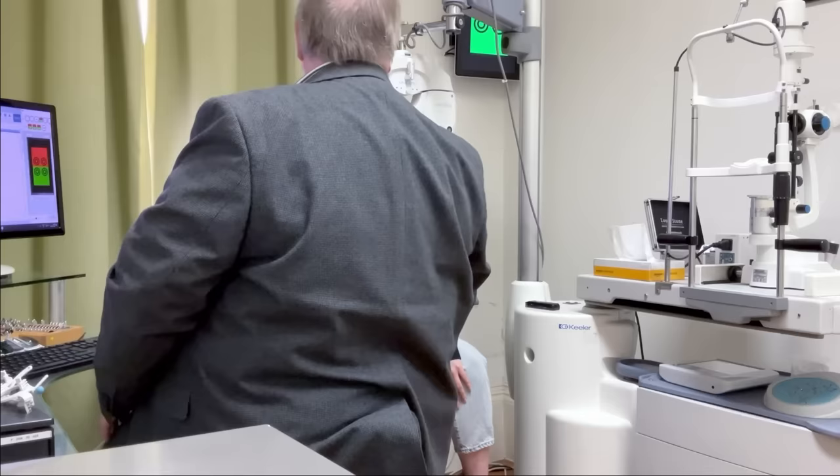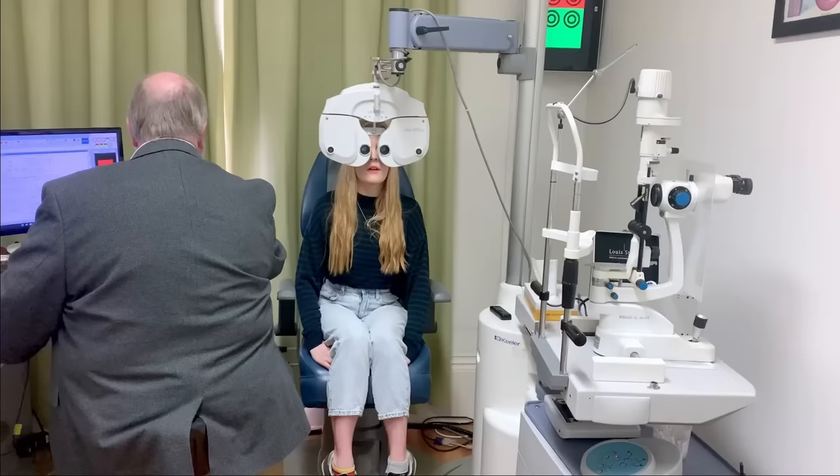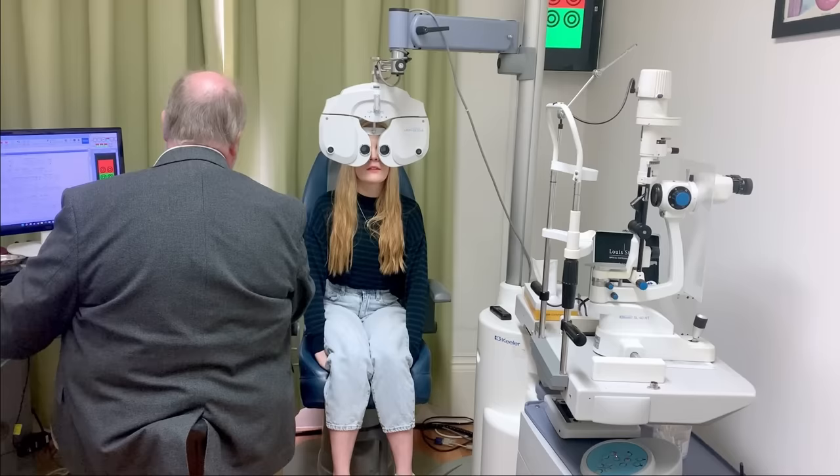So hopefully that looks a bit clearer. Feels a bit lopsided. You've got one eye clear and one eye not, okay? Yeah. So can you see the circles on the red and green? Yeah. Which ones look better? Circles red or circles green? Green, I think. Green a little bit, yeah? Yeah. How about with that one? Red. Red one, okay. Let's go back to that.